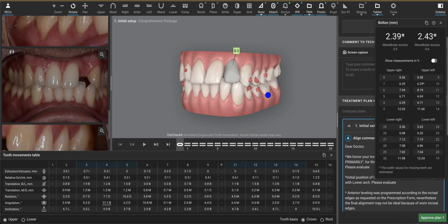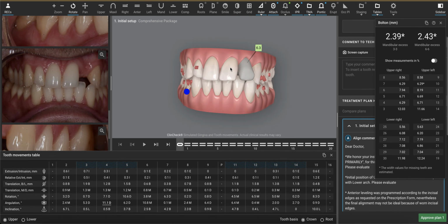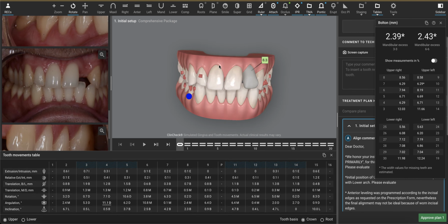So I'm much more likely to say do a 3-unit bridge and then 2 veneers here, maybe 3 veneers. And we actually increase the spacing here to increase the overjet, but also to optimize the aesthetics of these teeth as part of the rehab for this tooth here. So a 3-unit bridge, 3 veneers, and we use Invisalign to increase the spacing here to give us much better width to length ratios of the current teeth versus IPR in the lower.